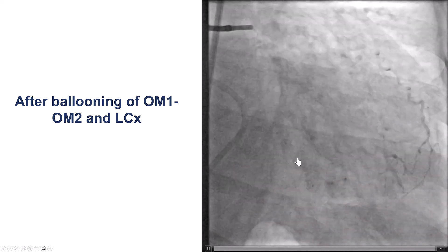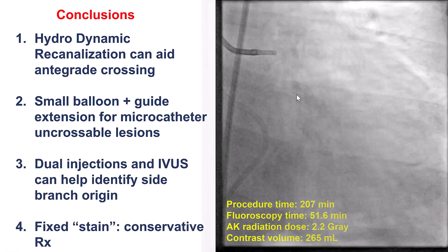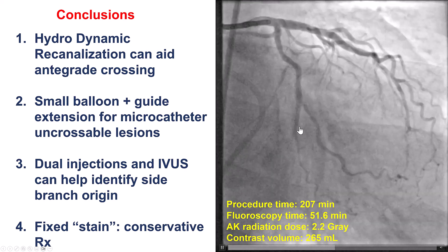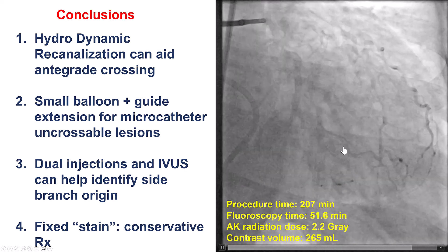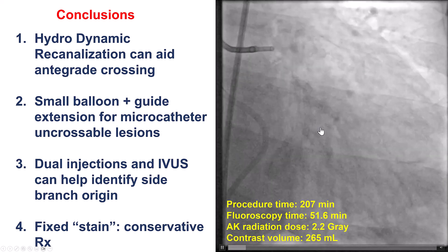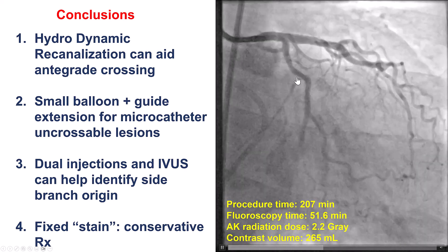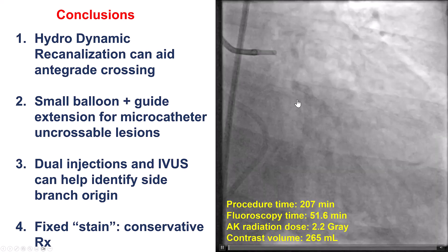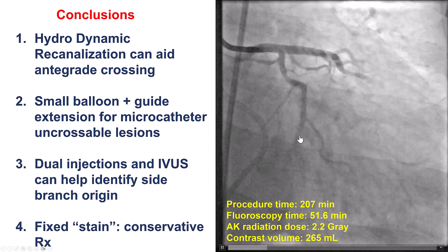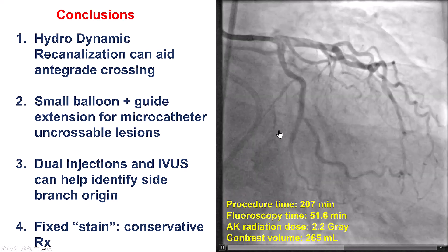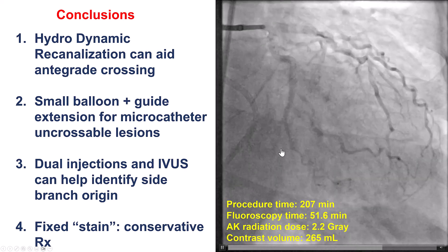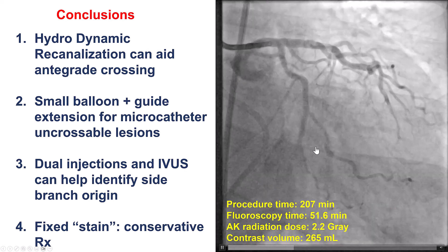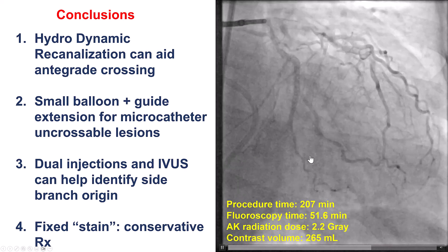We ballooned the two obtuse marginal branches as well as the circumflex. The result showed good flow in OM1 and good flow in OM2. The plan is to bring the patient back for drug-coated balloons. We decided to leave the distal circumflex, since we had adequate outflow for the first and second obtuse marginal branches.